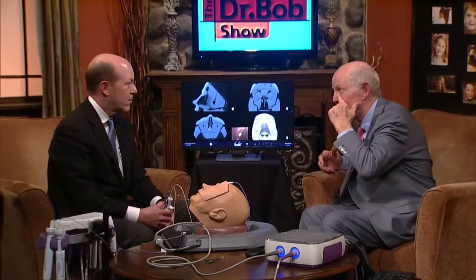We've unblocked it by balloon sinuplasty or balloon surgery, and that keeps the sinus opening where it will drain for a long, long time. Correct. And that relieves the problem of obstruction. And we're not cutting tissue and removing tissue, so the bleeding that was associated with traditional sinus surgery is basically alleviated with the balloon. Do you get better results with balloon sinuplasty or the endoscopic sinus surgery that you did early? They're both outstanding as far as results go.